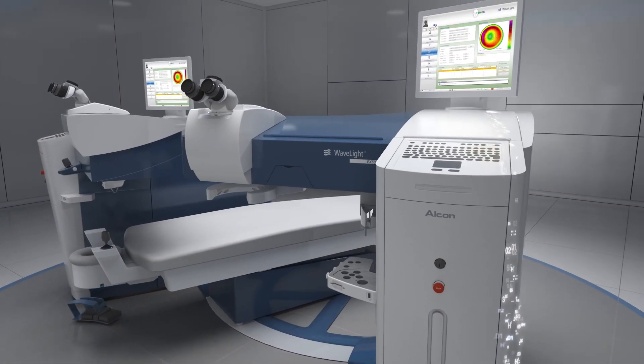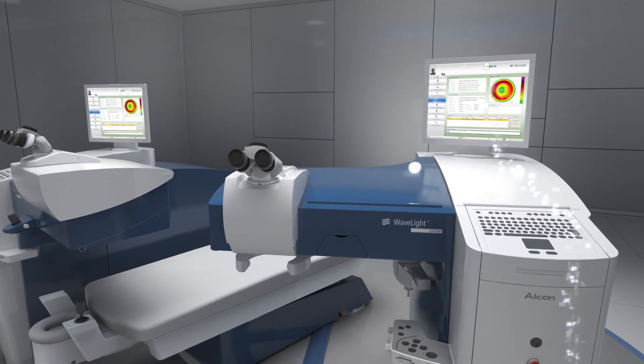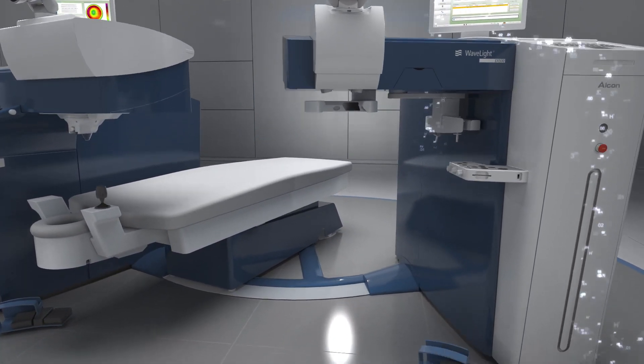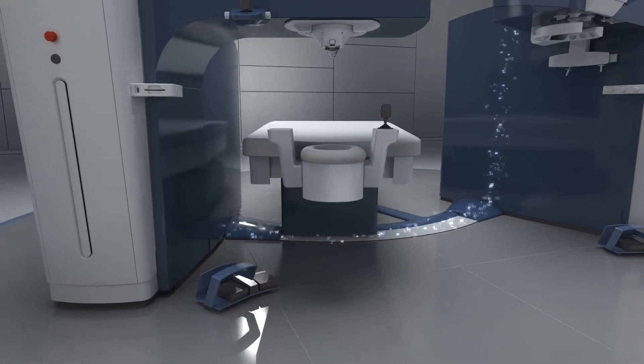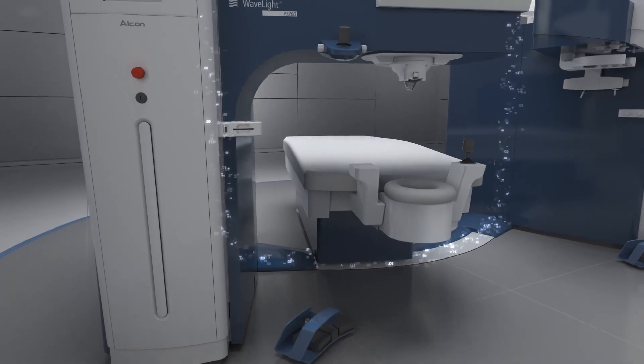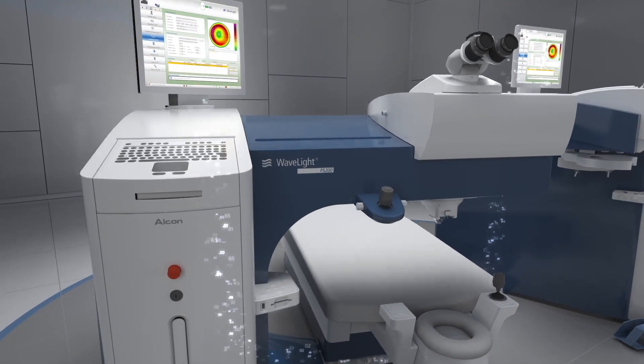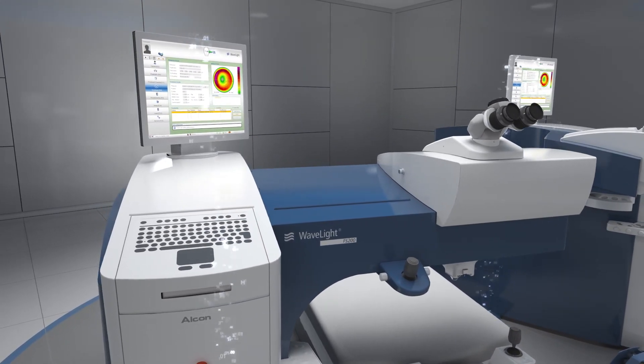Using the captured diagnostic data, the excimer laser creates a unique ablation profile. The ablation profile then travels from the Wavelight EX500 excimer laser to the Wavelight FS200 femtosecond laser, where a precise flap is created.